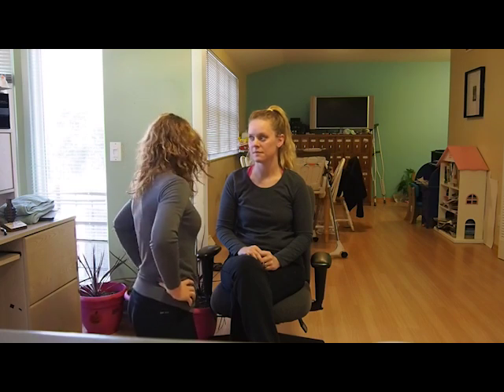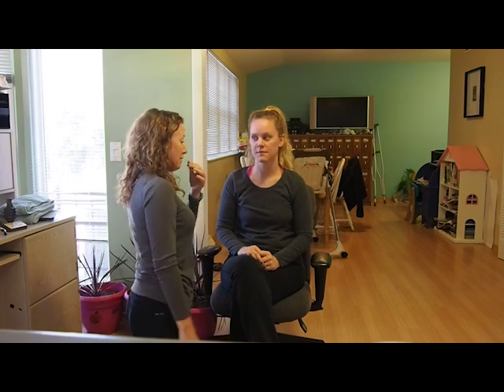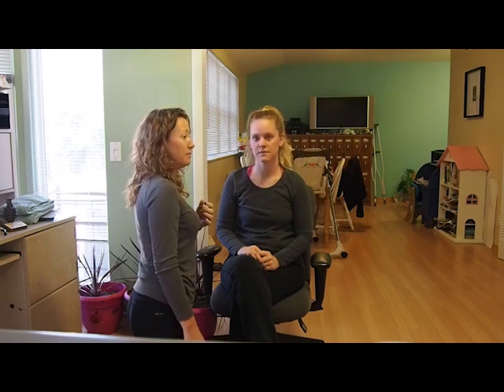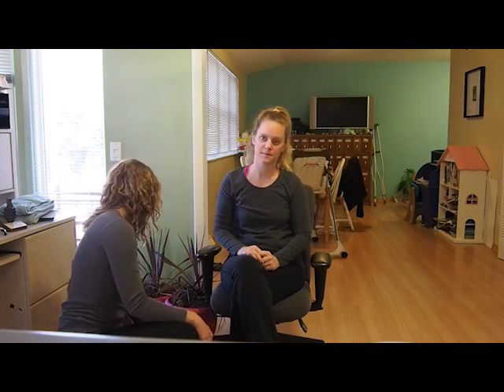Otherwise, again, you could use a pen light, you could use the otoscope or ophthalmoscope, the light source from that, to be able to look at the inside. Just looking to see if the internal nose structure is pink, it's moist, that there's no issues, no bleeding, no pain, anything there. And as far as assessing their ability to smell, that is done, again, when I spoke of the cranial nerve 1.